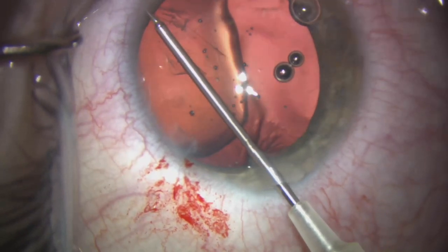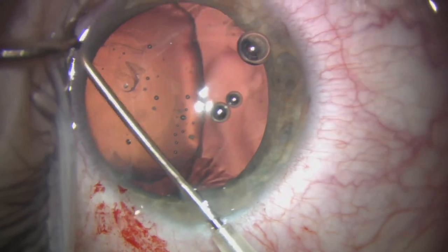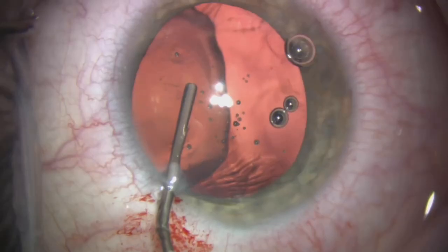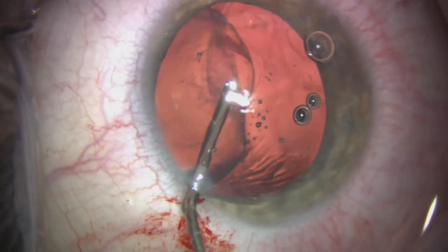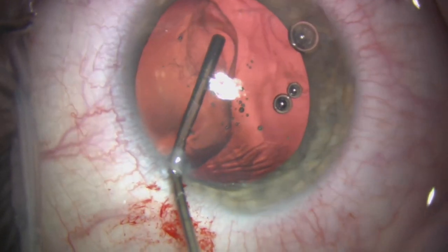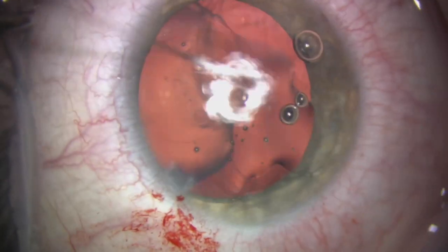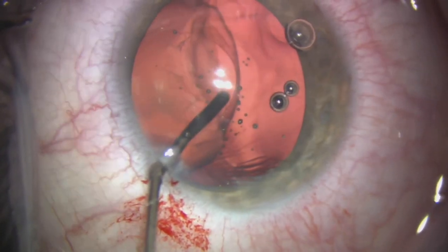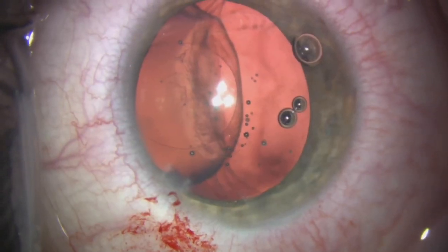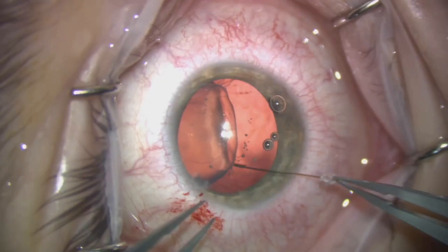We managed to fortunately complete the rhexis and remove the capsule. We're now using some Helon 5 again to expand the periphery of the capsular bag in the area of the missing zonules. You can see as we expand the capsular bag the capsulorrhexis looks a lot more circular now and far less oval.